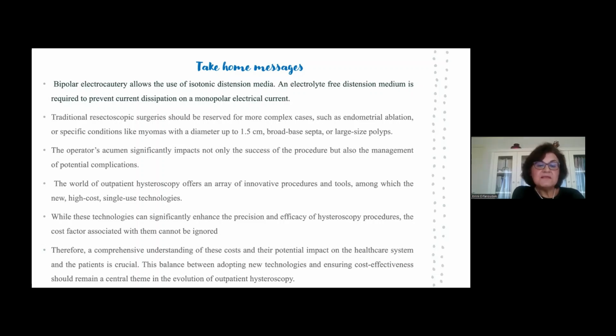While these technologies can significantly enhance the precision and efficacy of hysteroscopic procedures, the cost factor associated with them cannot be ignored. Therefore, a comprehensive understanding of this cost and the potential impact on the healthcare system and the patient is crucial. The balance between adopting new technologies and ensuring cost effectiveness should remain a central theme in the evolution of outpatient hysteroscopy. Thank you.